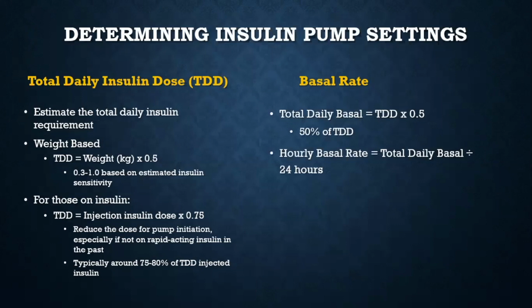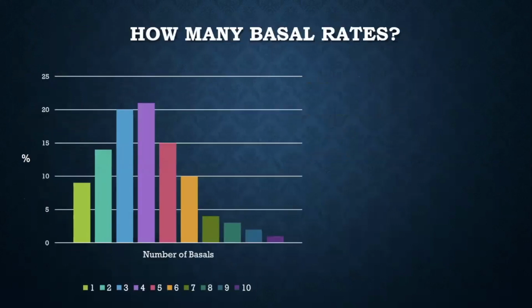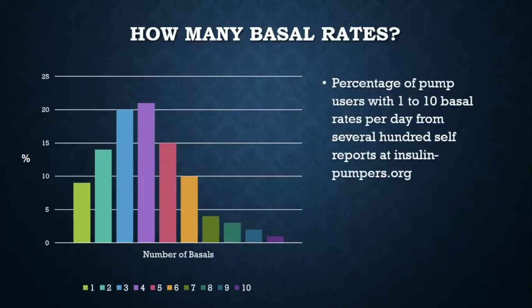The pump is able to change how fast or how slow it administers the basal. So you can change how much somebody gets for basal coverage during the day versus how much they get at night, especially for those who may be prone to overnight lows. When we think of this, we say, how many basal rates does a patient need? So maybe they require a little bit more insulin during the day or less overnight, or vice versa, actually. So pumps can be programmed to have many basals at certain times of day.